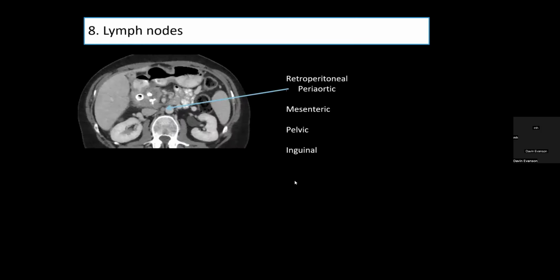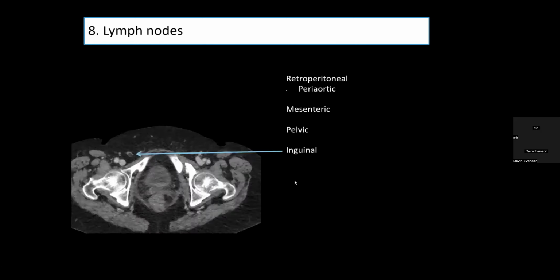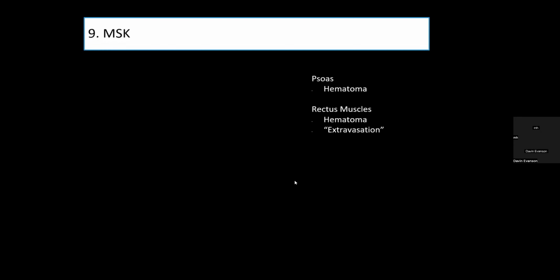Then lymph nodes, of course, mets, lymphoma. Maybe they're reactive. Looking all over the body for these.